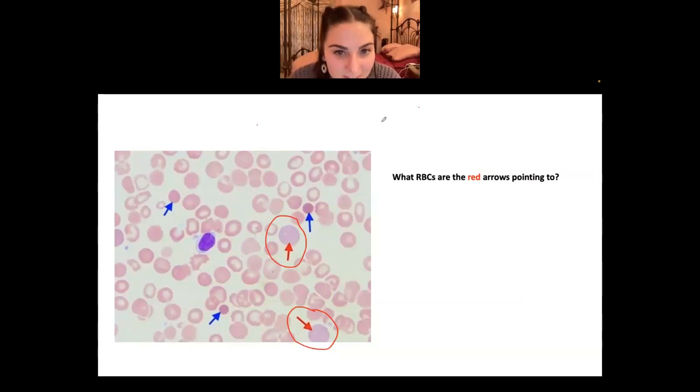Some of you said spherocytes. Spherocytes are very, very tiny cells. So if you're between the two, the spherocytes are really small, and these are really big. These are also kind of different colors, right? You can even see with the rest of the smear, these are all looking red, and these look a little blue or at least purple. They look a little different in color.